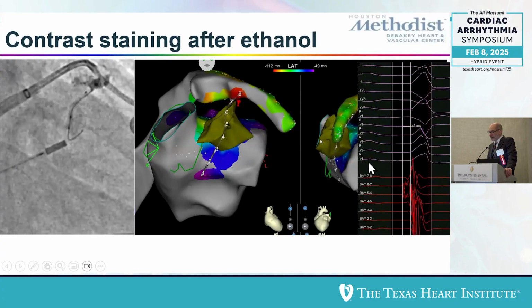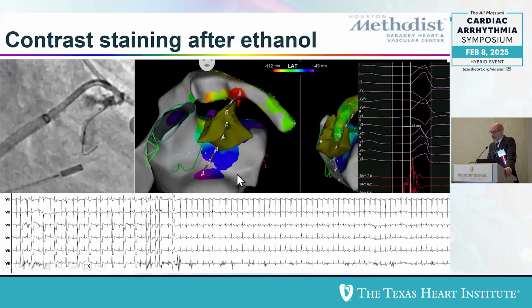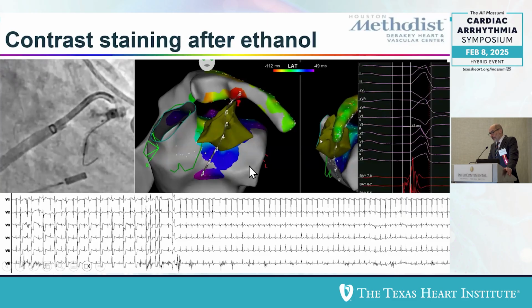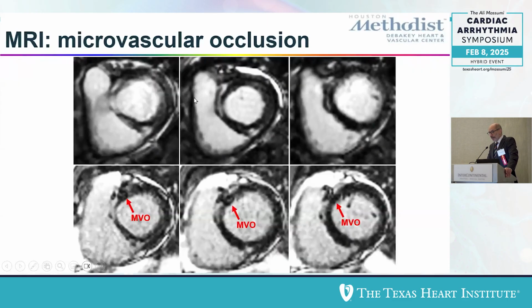This is the targeted vein on CARTO, and when you deliver the alcohol, the PVCs go away. When you're in the right vein, this happens routinely. When you're not in the right vein, then obviously this will not happen. So you gotta get used to mapping more than one vein when you try this.